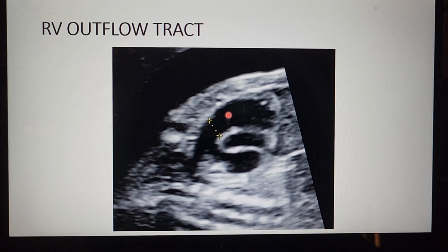From the right ventricle, we get the pulmonary artery which goes closely opposed to the retrosternal plane and goes posterior as a smooth, wide arc. Once the PA comes out, you can see the right branch pulmonary artery going off here. So this is the normal RVOT view.